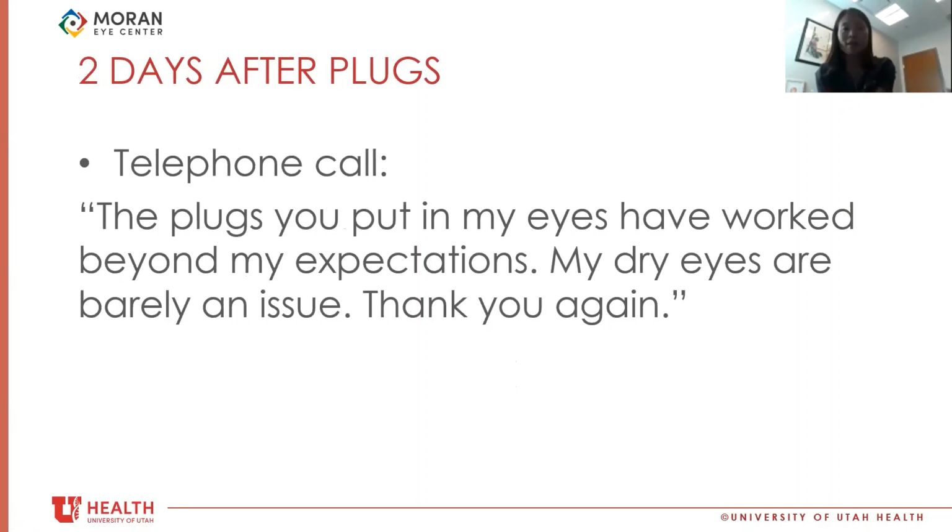A, in getting him to 20/20, which I wasn't really sure I could do. And B, I somehow corrected his hyperopia, even though I didn't really correct his hyperopia. I think what ended up happening is just maybe with the course of the diamond burr polishing, mechanical debridement, and just the way his eye healed, he happened to achieve a result of getting rid of most of his hyperopia. So this was kind of a case that turned out a lot better than I thought. That was it with that case. Questions, comments?